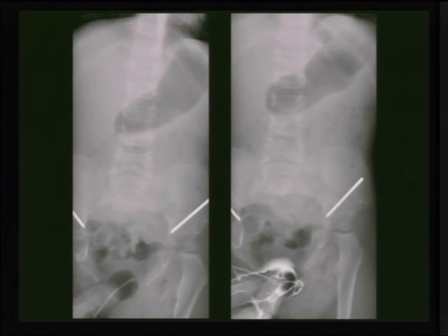Don't radiate yourself. Here, the one who is doing it is using his finger in the field of radiation. And here, in those images of ectopia vesica, we have used the Foley's catheter in order to see the reflux. If you cannot reach the bladder because of a tortuous urethra, don't do VCUG by injecting the contrast. This is dangerous. You can see in the last images some of the vessels. So there was intravasation of the contrast, and you may cause septicemia this way.